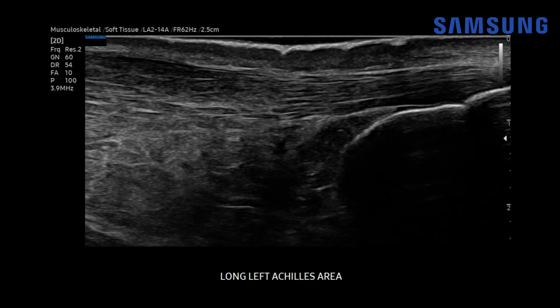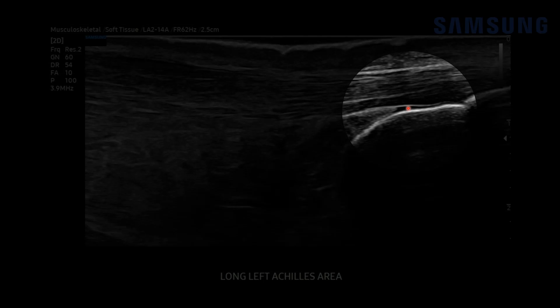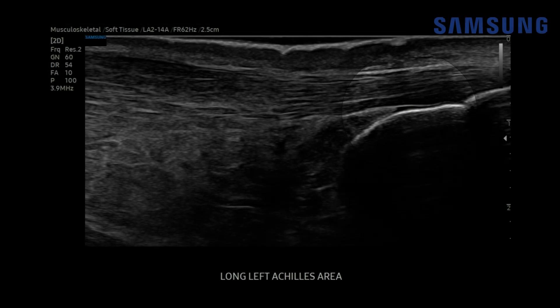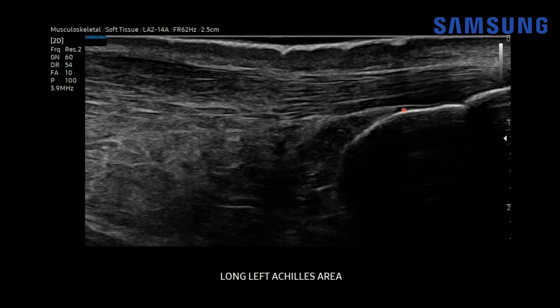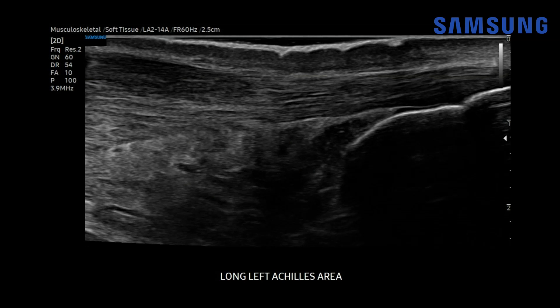Here we're seeing the Achilles tendon attachment at the calcaneus, and there's a trace amount of fluid in the retrocalcaneal bursa — that's normal. It's normal to see up to 3 millimeters of fluid in the AP dimension. The retro Achilles bursa would be located here, and that normally has no fluid. This heterogeneously echogenic area is known as Kager's fat pad, and that has a normal appearance. The Achilles tendon should normally be uniform in thickness and echogenicity in the longitudinal plane, as we have here at the inferior aspect.